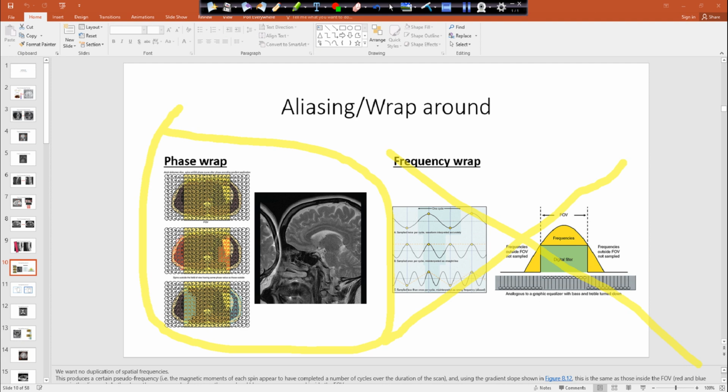So here we have the abdomen, and we have, basically the hip or basically the sides of the patient wrapping into our field of view. So basically, we are undersampling all the data that's underneath the coil. So that coil sits on top of the entire abdomen, right? So anytime you have a coil on top, and remember on the table you have the coils, so all that data still needs to be encoded in one form or another.